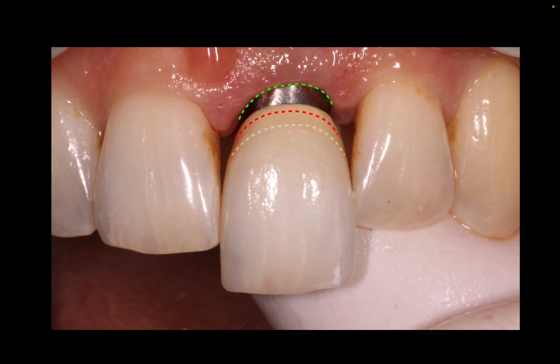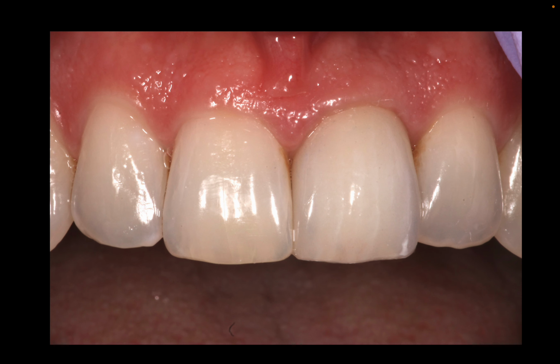As this restoration is seated, and let's move the red line to where it's going to ultimately end up, you can see that it is broader than the green dotted line. This is going to have the effect of pushing the tissue against the adjacent teeth, and the tissue will also be pushed incisally to help fill the gingival embrasure. As this tooth is placed, and we look at it post-delivery at 2 weeks, you can see now we have complete gingival fill.